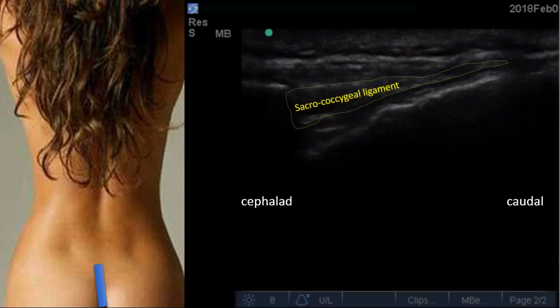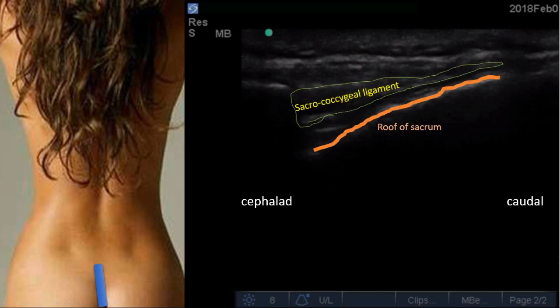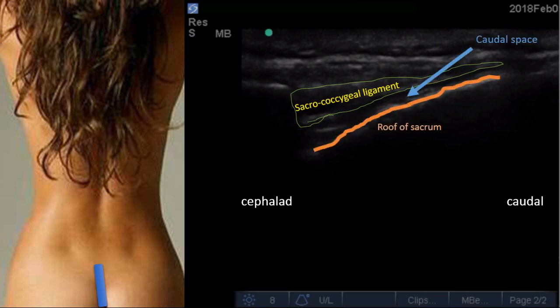Here the ligament is very well visualized, the roof of the sacrum is also visualized, and in between we find the epidural space at the caudal level. By entering from lateral to medial or caudal to cephalad, we can see the needle in-plane in real-time view.